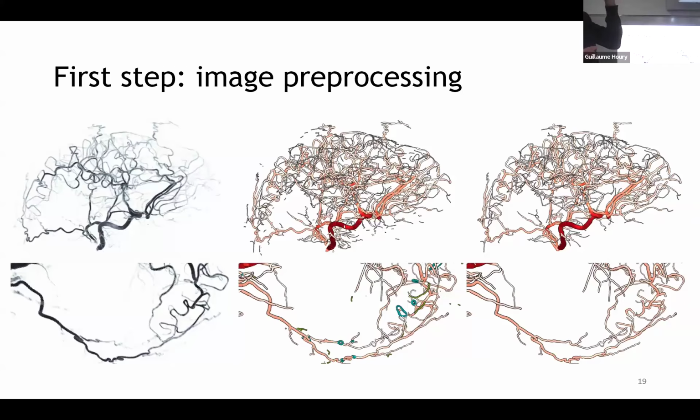So here, the images that you're going to see are from the Hôpital La Pitié-Salpêtrière in Paris. And basically what happens is that there's an intervention going on, and the patient is completely paralyzed, which means that the respiratory motion is artificial.